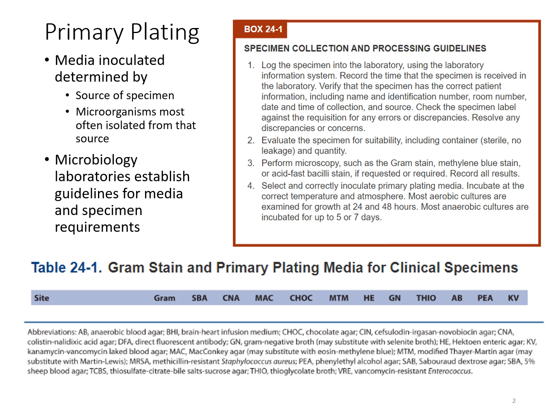Your anaerobic cultures, of course, would need to go into the special incubator or the bag or whatever is used for those anaerobic cultures. And then, of course, they will typically be looked at and reviewed for an extended period of time for those anaerobes, to give them time to grow.